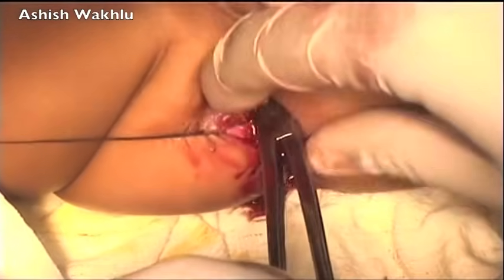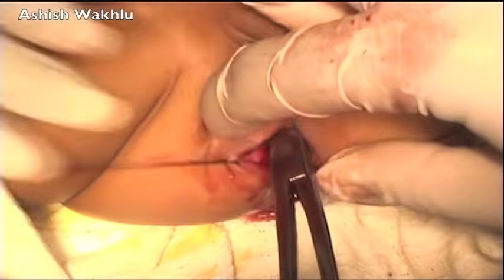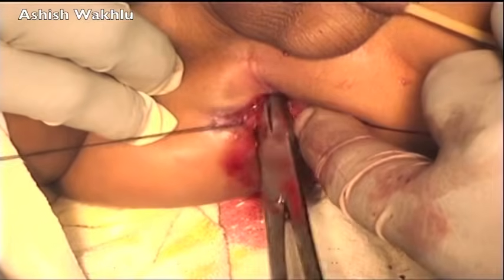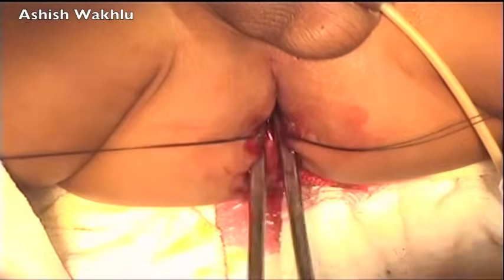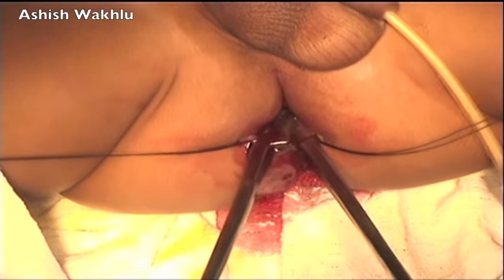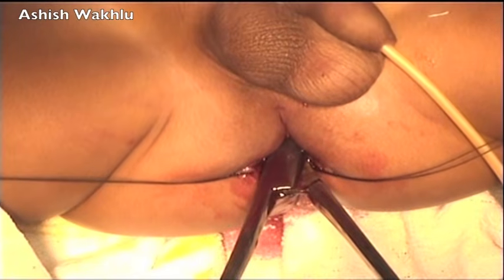Finally, the tip of the artery forceps enters the peritoneal cavity, and it is spread a little to create a passage to let the dilated rectum and the terminal end fistula through to the perineum. There are many ways of pulling down the mobilized rectum through to the perineum.